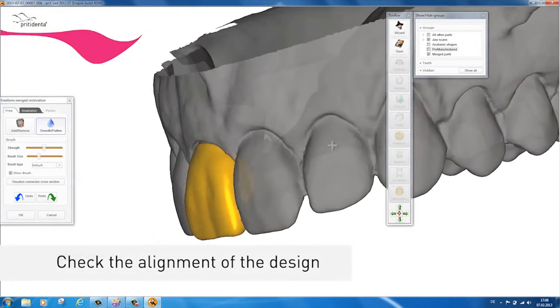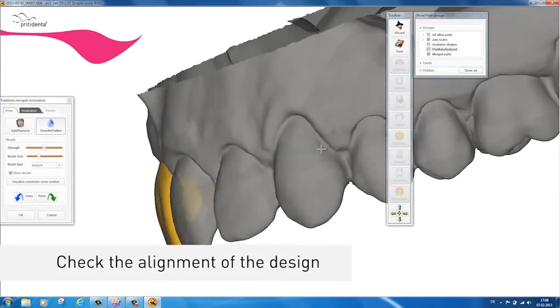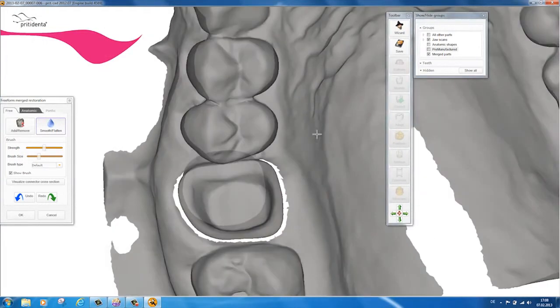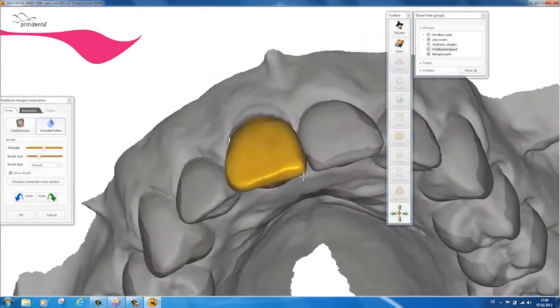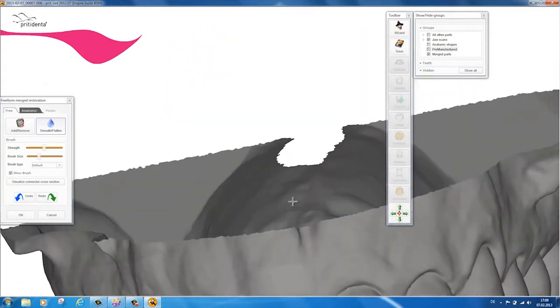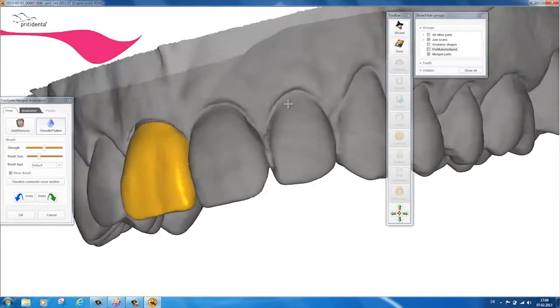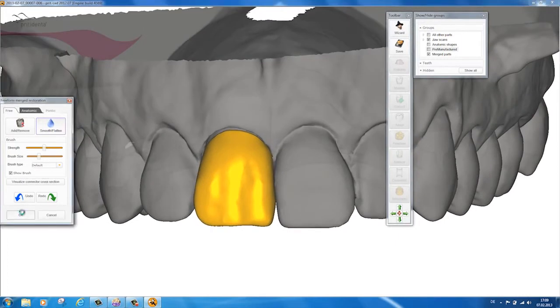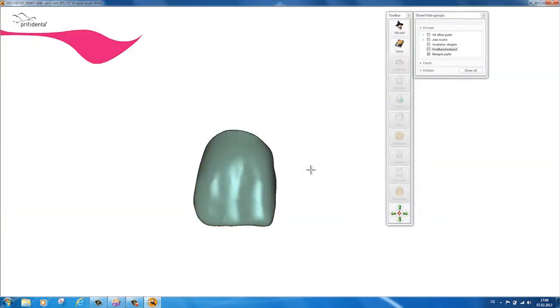Now check the whole design once more. Then save the STL file ready for exporting to the grinding machine or grinding center.